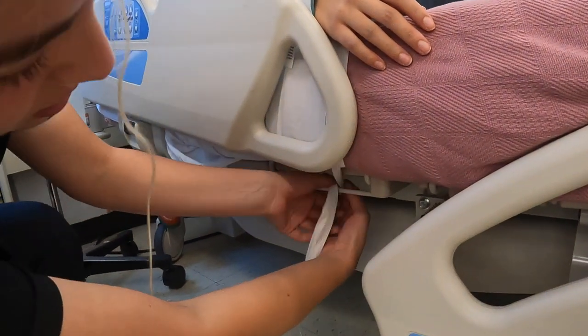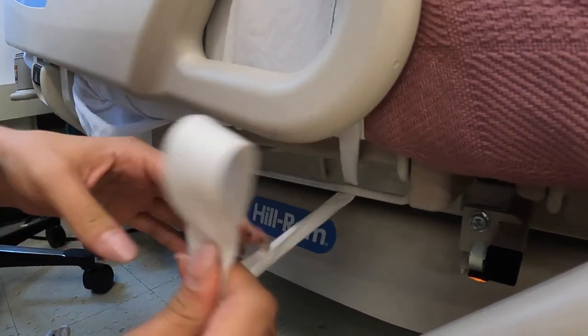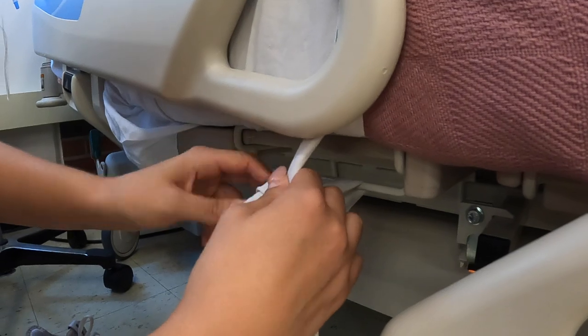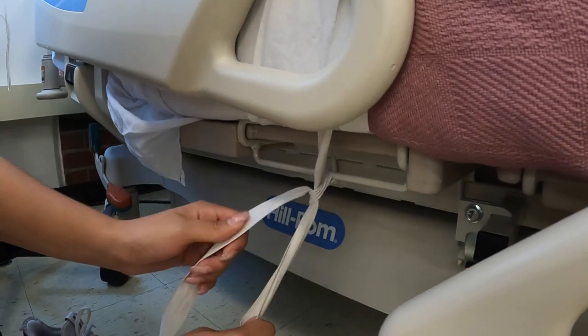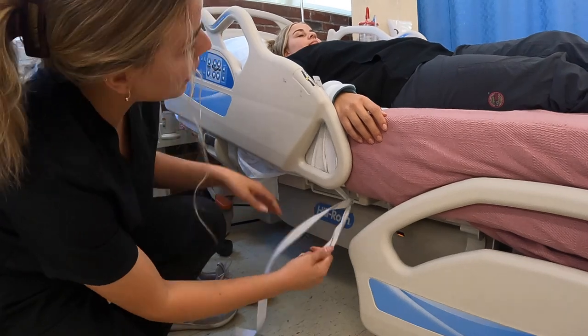So what I'm gonna do is go through here, and then like tying a shoelace, I have one bunny ear, I'm gonna go through the hole and then down. As you can see right here, it's tied.